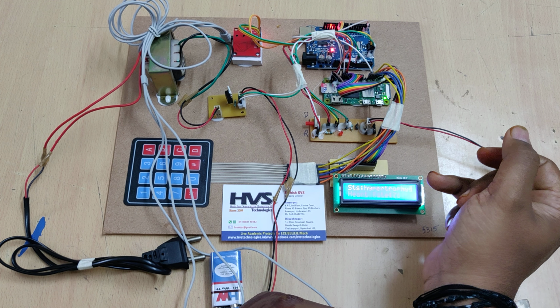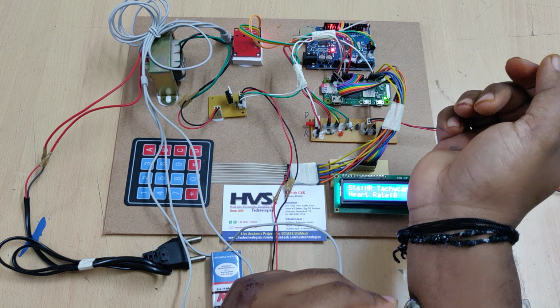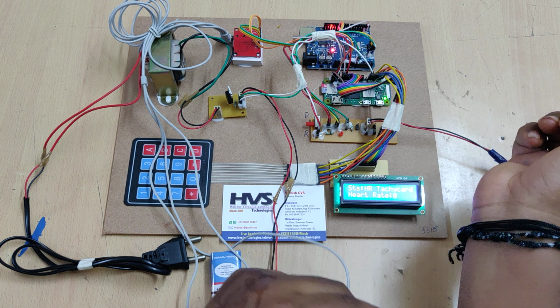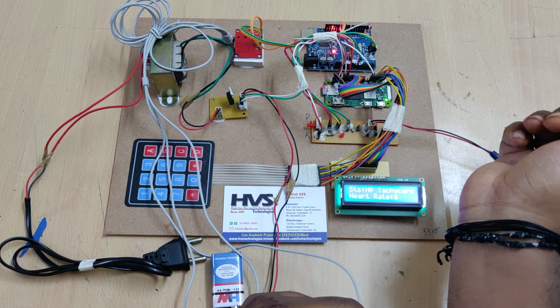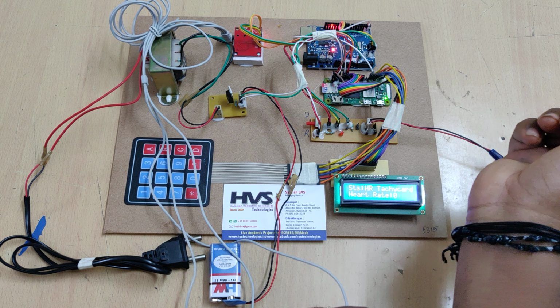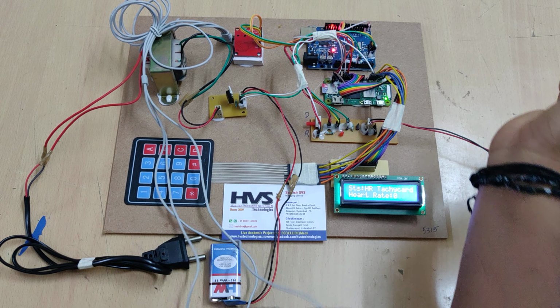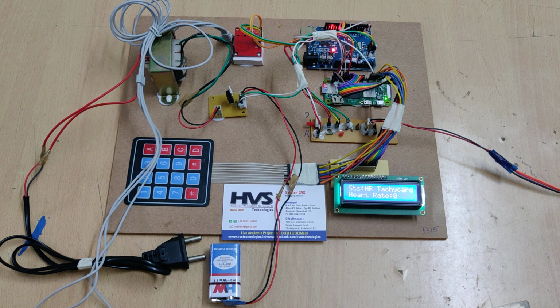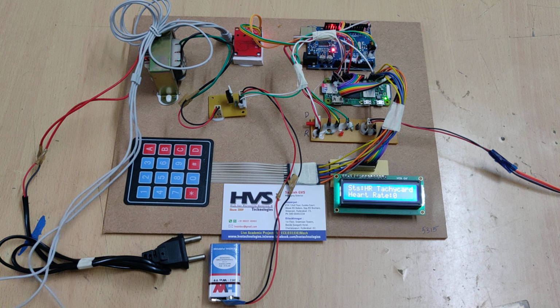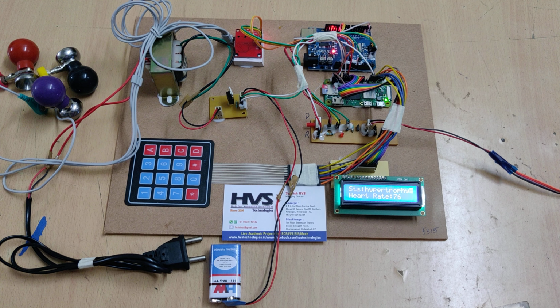We have to mount that properly. When it shows 0, it comes under abnormal, that's why it is showing the disease over there. Right, so it's normal, as you can see. Once it matches the skin resistance properly, it will show you the normal condition along with diseases and heart rate. Thank you.